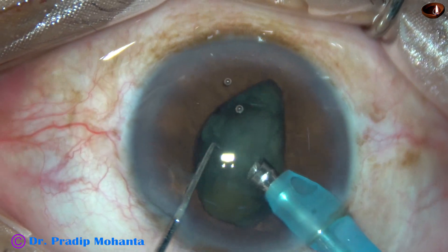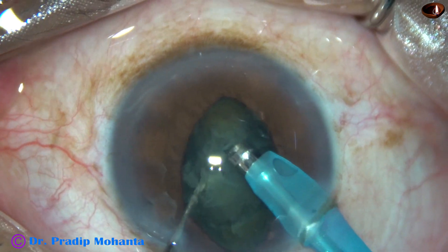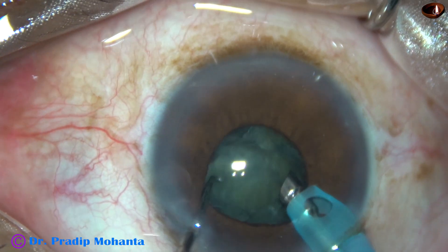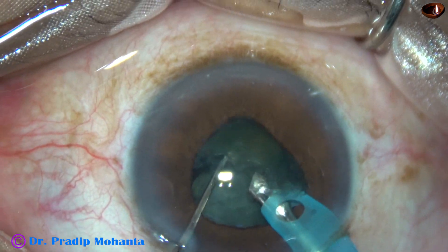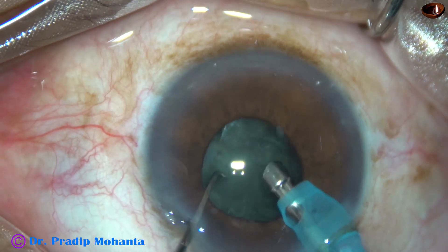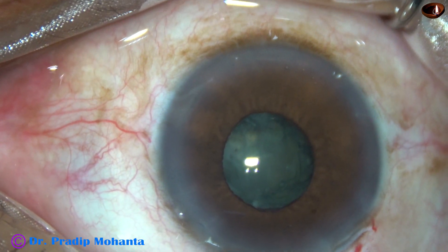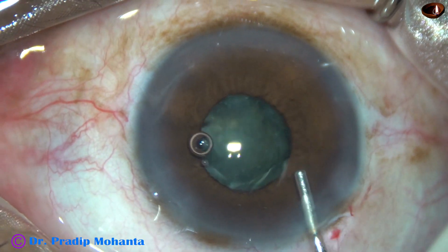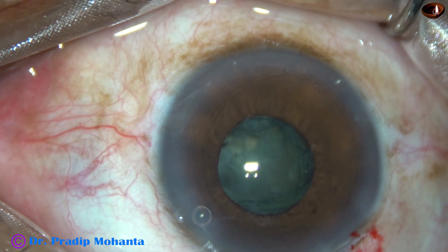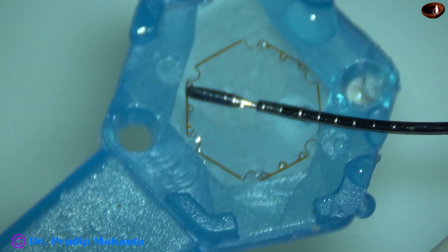I could make a crack. Now I am going to emulsify the portion which is sub-capsular. I could crack the nucleus a little more. The pupil has constricted to a great extent — the size is now about 3 mm or 3.5 mm. We can complete this case without using a pupil expansion device, but I thought of using one for better safety and visibility.